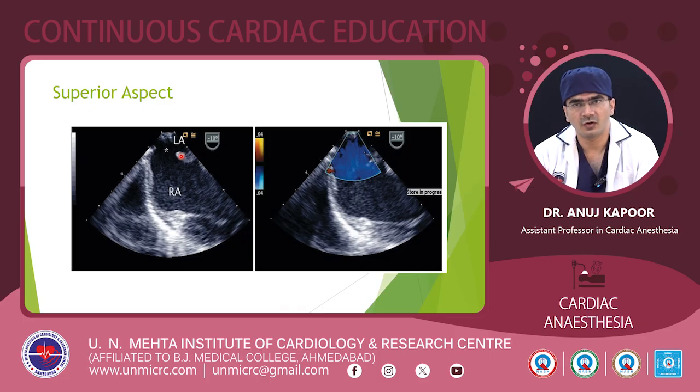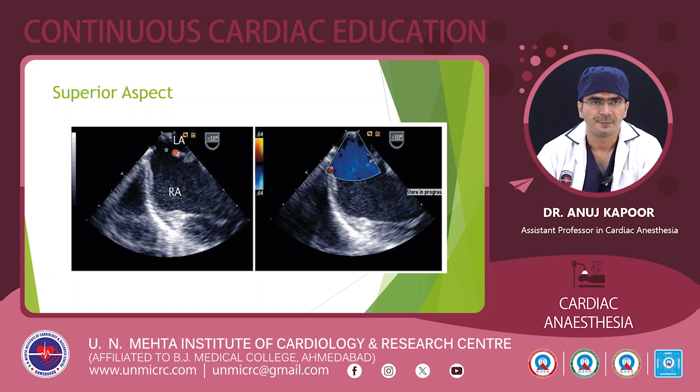So progressive withdrawal of the probe in the mid-esophageal four-chamber view to above the level of the fossa ovalis demonstrates the superior aspect of the interatrial septum. The location of the superior sinus venosus defects as well as the SVC is visible in cross section, and anomalous drainage of the pulmonary veins as they enter the SVC can be seen in this view. This view is typically important for a sinus venosus defect.